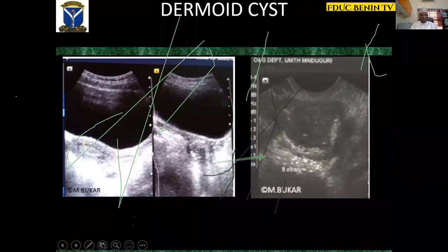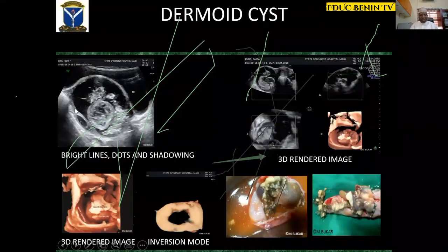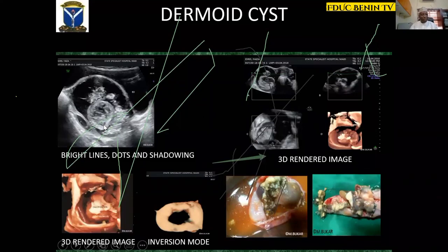A 17-year-old presented with long-standing lower abdominal pain; transabdominal and transvaginal ultrasound showed an echogenic area with shadowing — confirmed dermoid at surgery. 3D ultrasound was tried on an 11-year-old, but it gave no additional information beyond 2D — the smooth wall, fat ball, calcification with shadowing, and hair were all visible on 2D. In over 90% of cases, we do not need more than 2D ultrasound scan for common benign adnexal lesions. The single most important ultrasound appearance of dermoid is an echogenic component. Beware of confusing adjacent bowel containing air with dermoid — bowel is outside the ovary. Corpus albicans should also not be confused with dermoid.